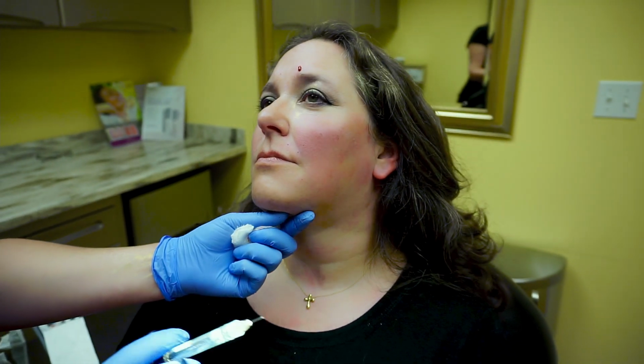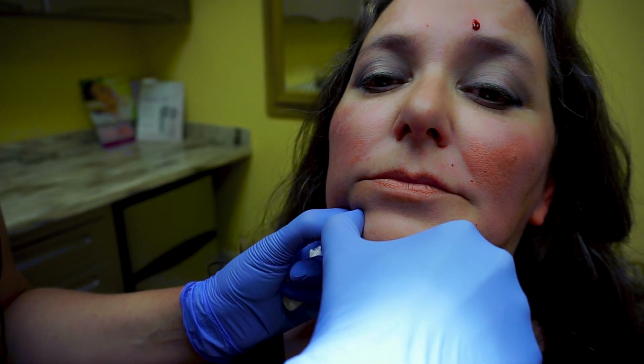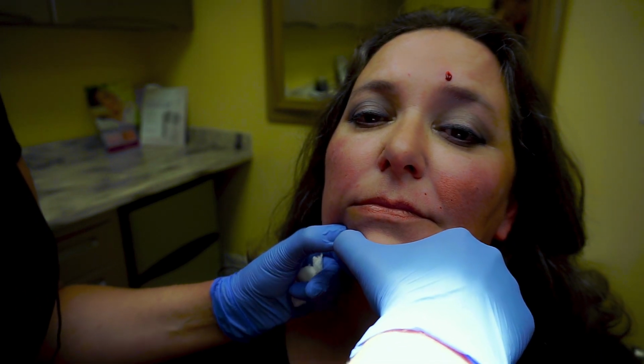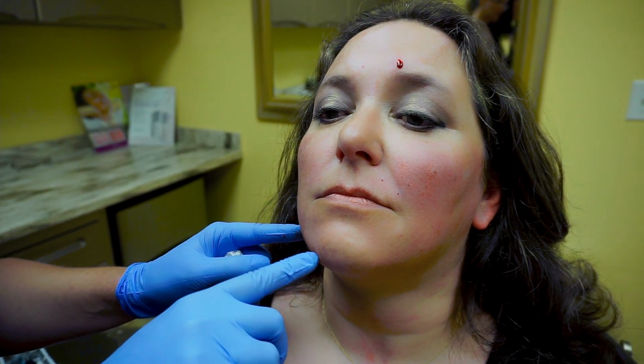until it's right. Okay, now turn back. Yeah, that's nice. It gives some sharpness to your... Look at that. So now it's straight across here. Mold it in a little bit. Okay, let me see. Wow, that's really nice. Can you see that? Look at it's straight across here, but up here.